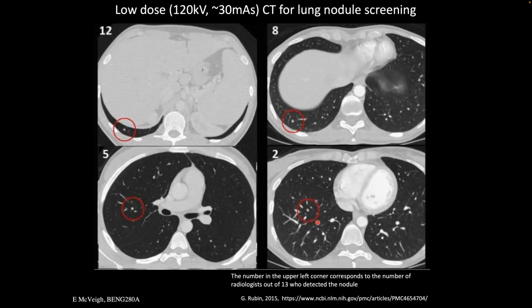So you can go back, find the CT, know that that's a positive lesion, and put it into the training set, right? And so now you can be reading these, except your buddy is a machine that has read 1 million of them and can point to one and say, this is really suspect. You should pay attention to that one.